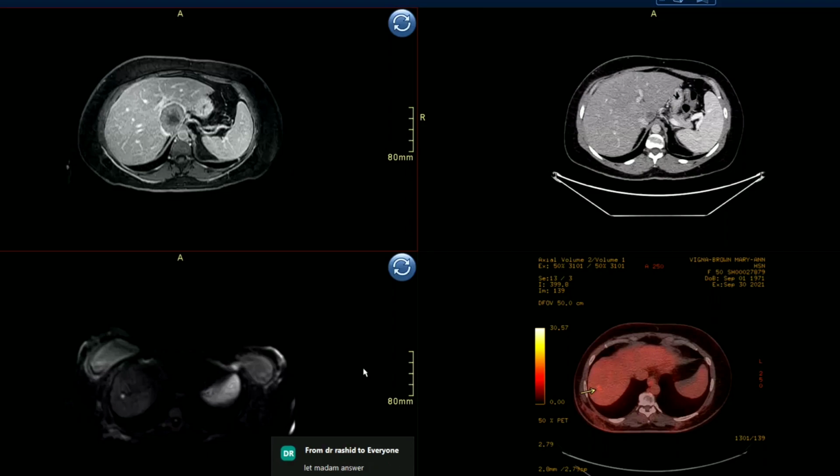You're doing serial mammograms and you say that the scar is changing. There are new calcifications there. There's a mass. So that could be recurrence. That is what recurrence is.